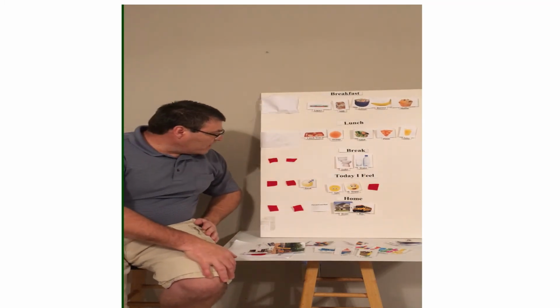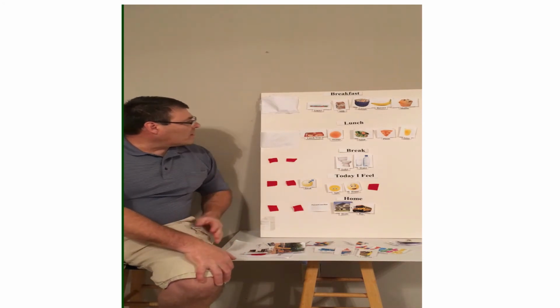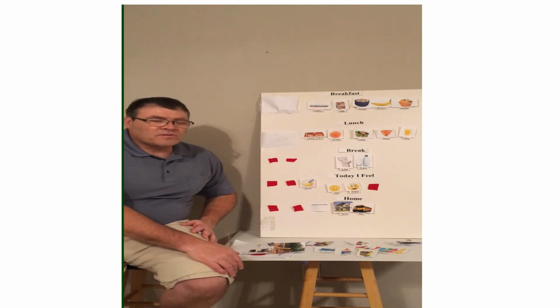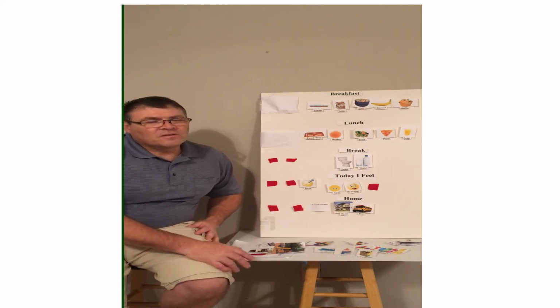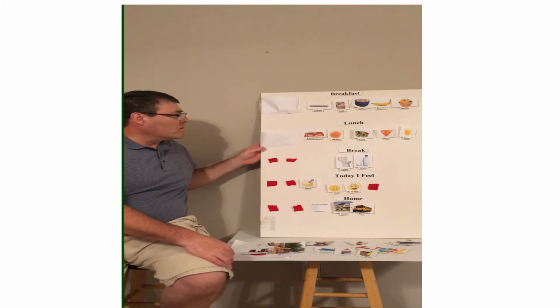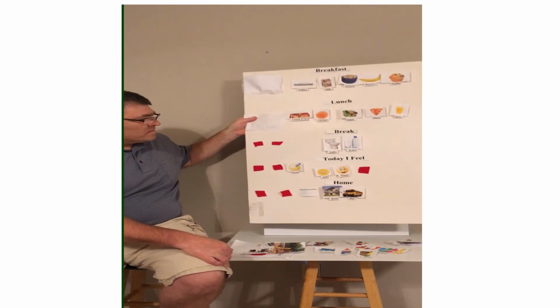But anyways, this communication board here I like because it allows them to know what's taking place, and it allows for the student to have a choice. Now this one here is used for children who are nonverbal, and seems to work fairly well.